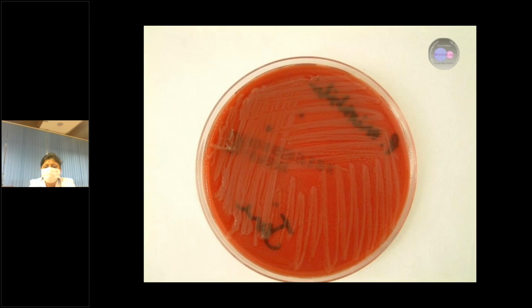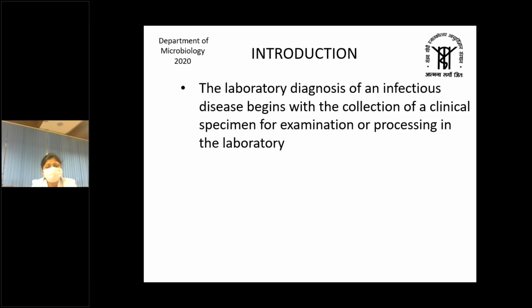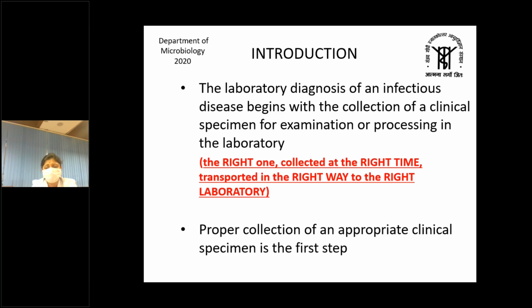Then culture. We routinely culture the organisms in bacteriology on routine culture plates, or we have specialized media in various sections to culture the pathogens. So the laboratory diagnosis of an infectious disease begins with the collection of a clinical sample for processing in the laboratory: the right one collected at the right time, transported in the right way to the right laboratory.